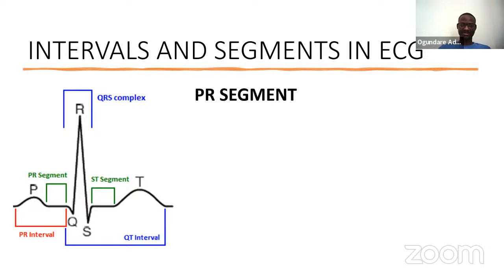So the next segment here is the PR segment. If you look at the green column here, this is the PR segment. I want you to pay closer attention to this. I'm sure with the understanding you've had so far, you should be able to define what the PR segment represents, and subsequently you'll be doing that for me in the chat box. But let me help you with this.